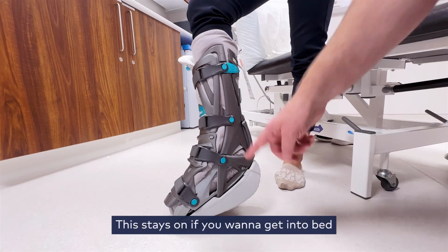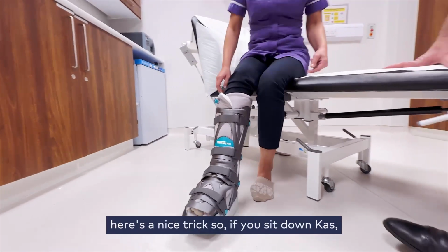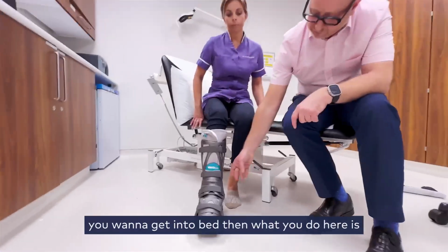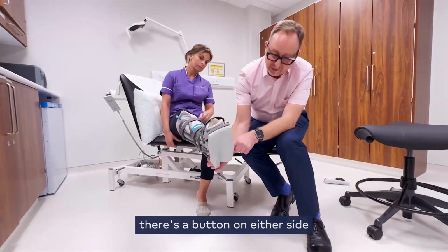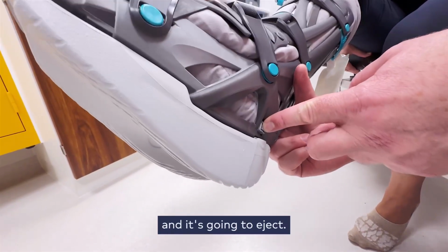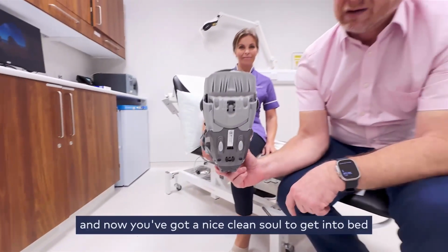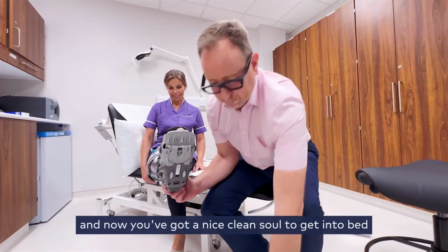This stays on. If you want to get into bed, here's a nice trick. So if you sit down, Cass, and you want to get into bed, then what you do here is there's a button on either side we talked about before. Okay, all you do is you push the two buttons and it's going to eject. Okay, and that's the end of the foot. And now you've got a nice clean sole to get into bed.